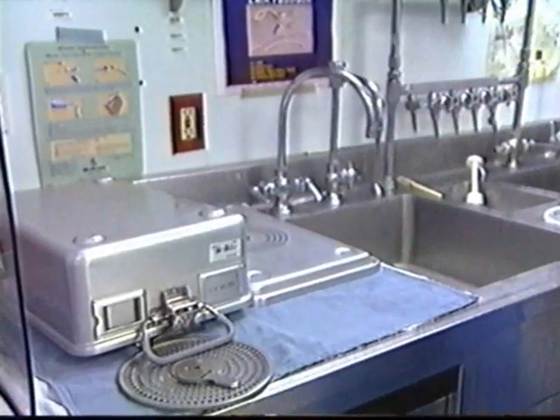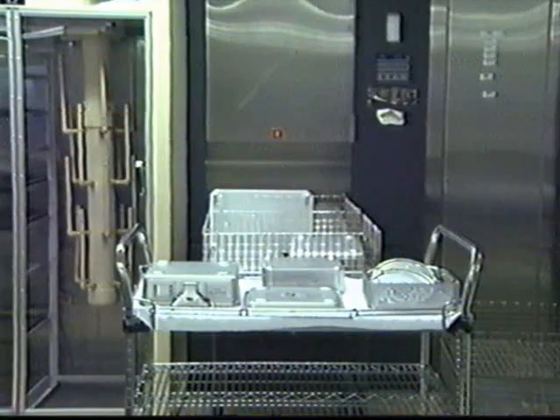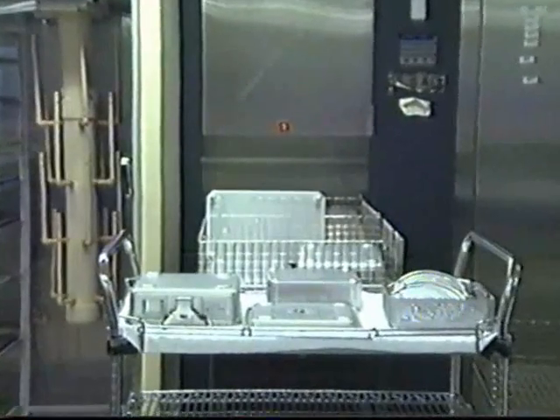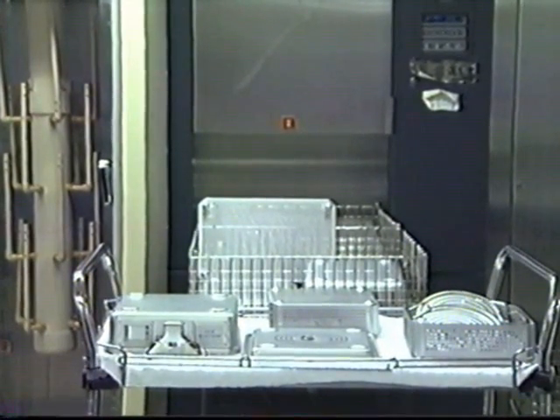Detergent residues can affect coloration and the appearance of the container surface. Try to avoid water collections by washing and drying the container upside down. Use a soft cloth to dry all components of the container.